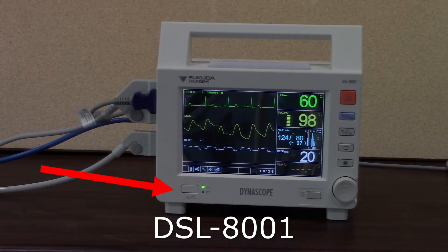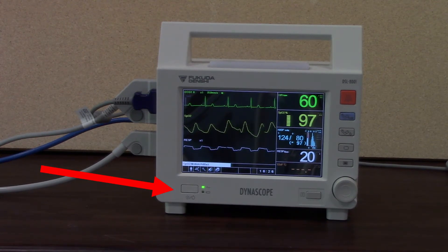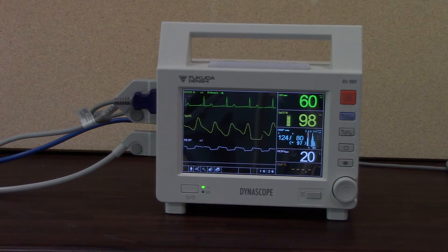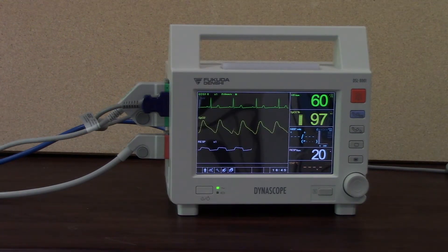Welcome to this short training video on the DSL8001 patient monitor. I'm going to run through some of the user keys and various functions within the DSL8001 monitor, which will then enable you to be able to use it. I'm going to show you where to plug the accessories in.